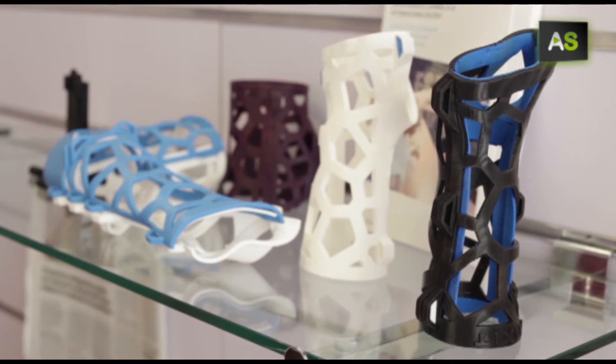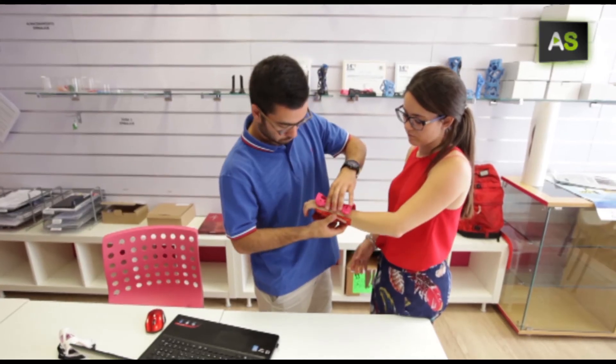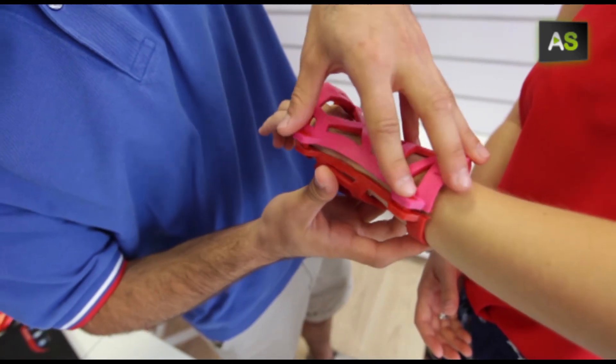As well as putting an end to the discomfort of a cast, it allows patients to start the rehabilitation process as soon as possible.